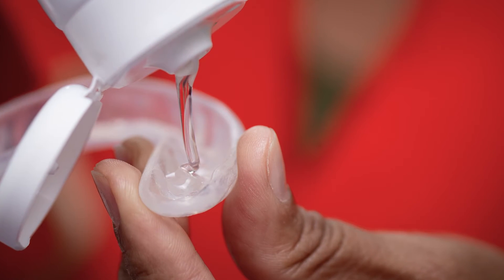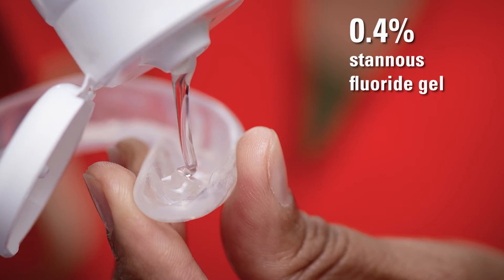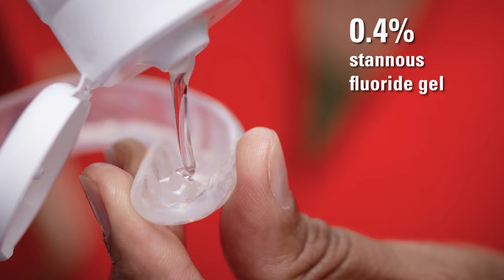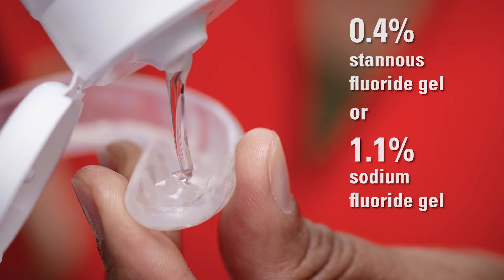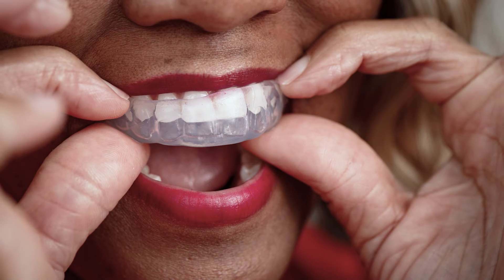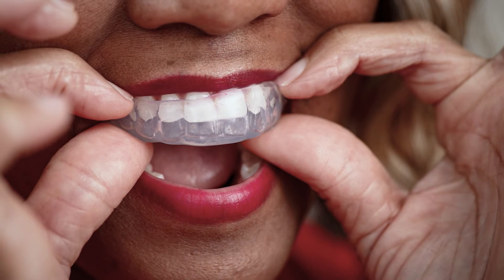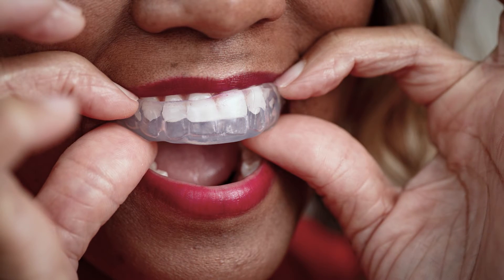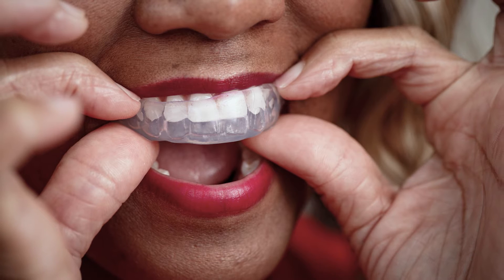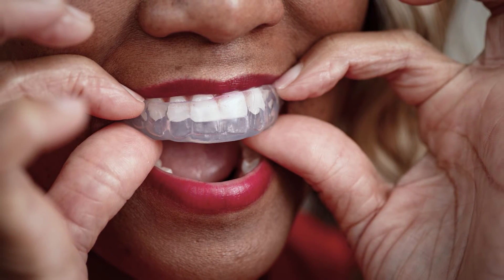Add a thin layer of fluoride gel into the fluoride trays. Either 0.4% stannous fluoride gel or 1.1% sodium fluoride gel can be used. Place the trays over your teeth for 10 minutes. Spit out any excess saliva or fluoride during the 10 minutes. Do not swallow any of the fluoride and saliva mixture. Remove the trays and any of the remaining fluoride gel from your mouth.